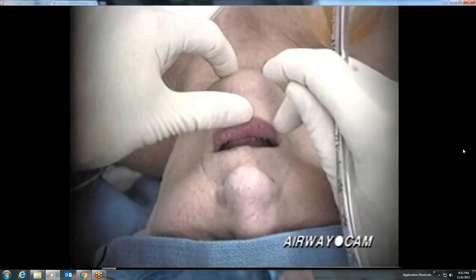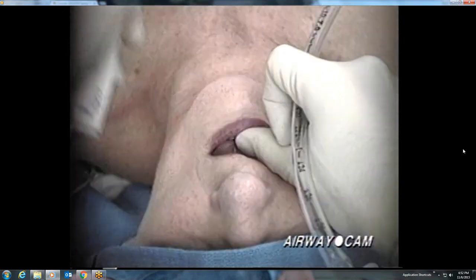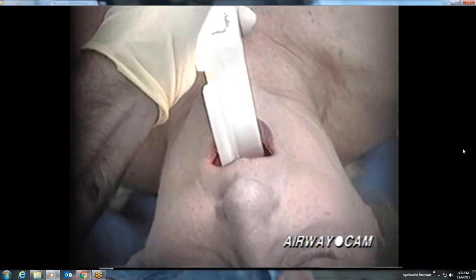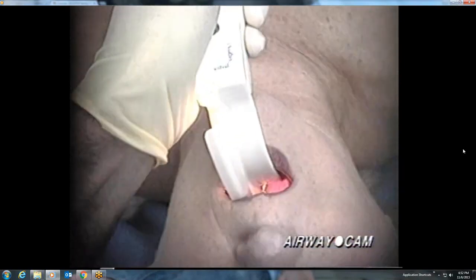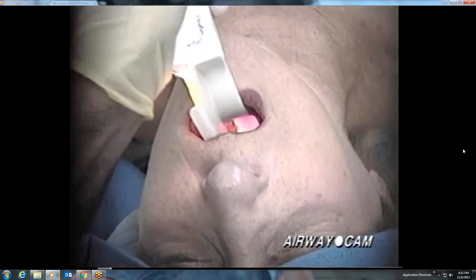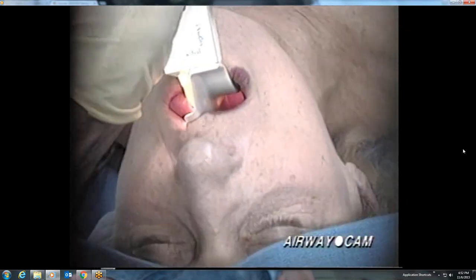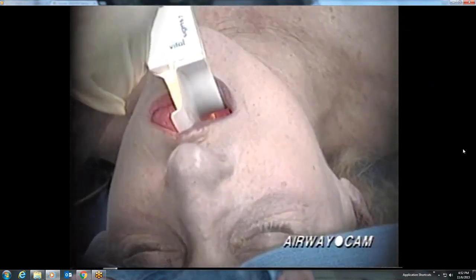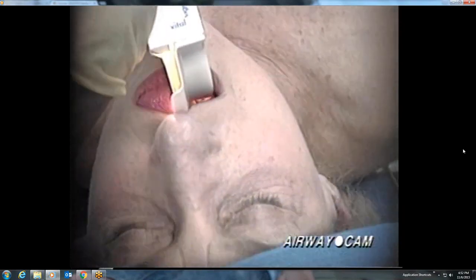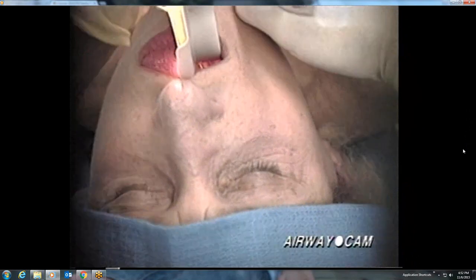This next intubation is done with a Macintosh No. 3 blade with a fiber optic light source on an elderly woman with no upper teeth. When it comes to direct laryngoscopy, no teeth almost always means no problem. Here the posterior pharynx is well seen, and the blade is further advanced. The posterior cartilages come into view.